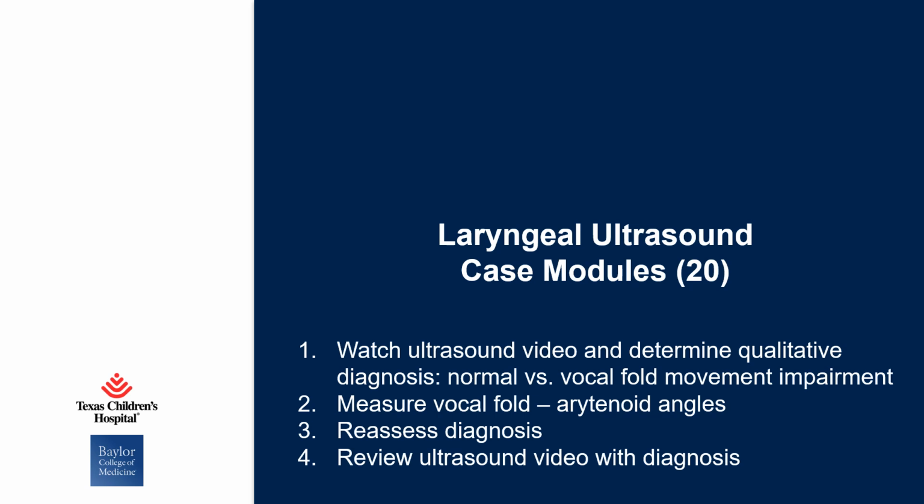Then, on the next slide, you'll have the opportunity to review the ultrasound video again, this time with our diagnosis on it, and see if you agree with us. Feel free to pause, stop, or rewind these videos as often as you need to make the diagnosis.